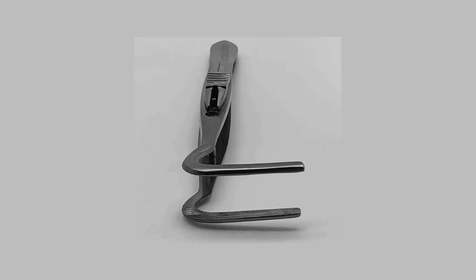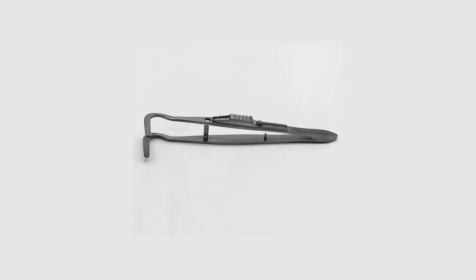In this video, we will discuss the burktosis clam and its uses. We will also discuss some of the ways to prevent complications associated with its use.